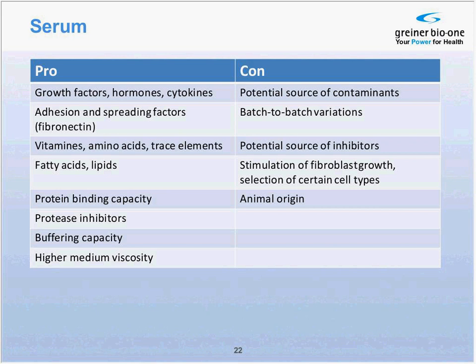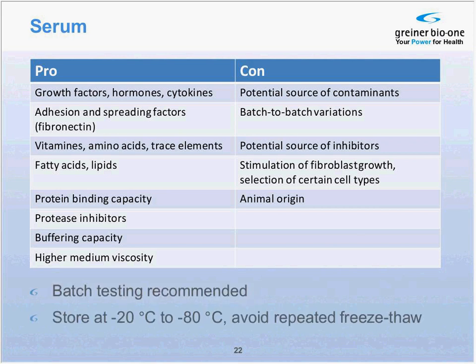As with most protein solutions, repeated freeze-thaw cycles are not recommended. The complexity of its mixture makes it sometimes not preferable for certain experimental setups, such as migration assays. The downside of omitting serum might be decreased adhesion and proliferation of the cells.